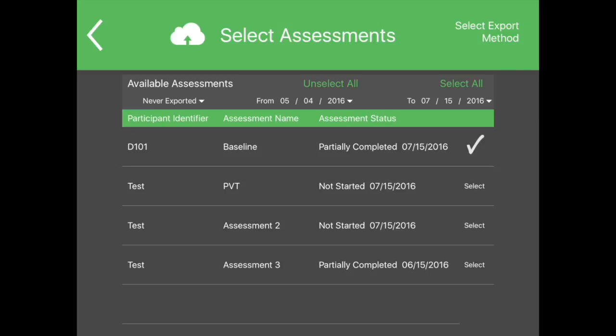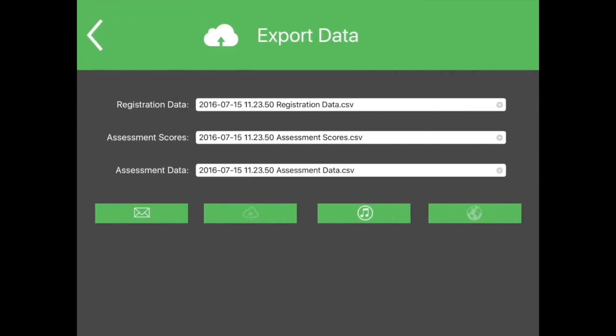When ready to export the selected files, touch the Select Export Method button in the top right corner of the screen. This will create or update data files for export. There are three types of data files generated here.